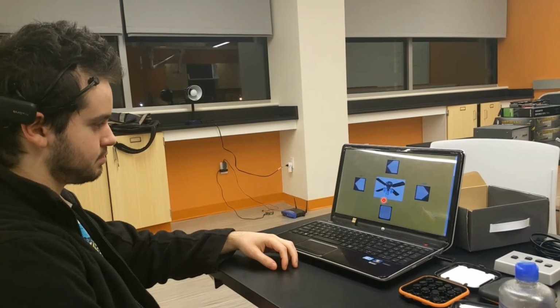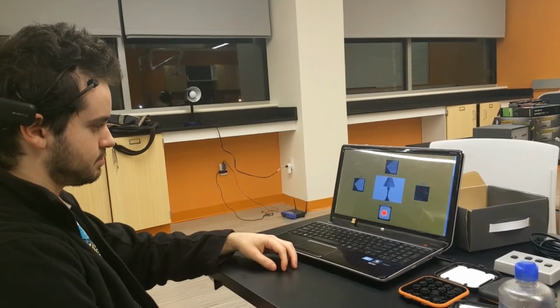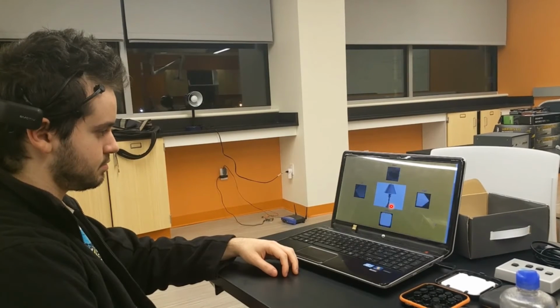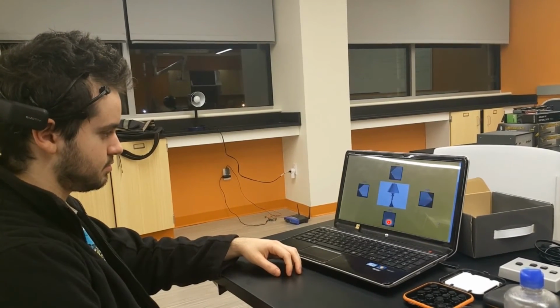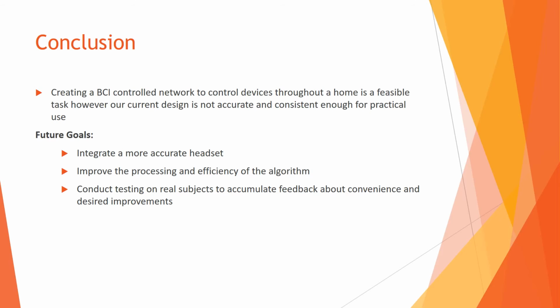So here we will soon see the light turn on because the user is looking at the select button. The user was looking before at the left button, so it switched to a different device or different lamp. So in a bit the user will turn on the device just by looking at the select button. There we go.